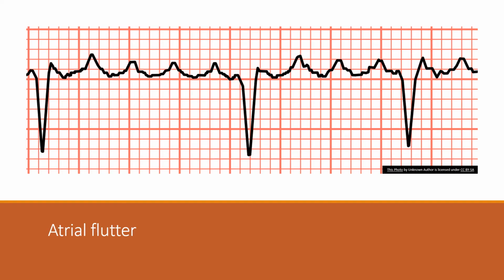This is unique because it's generally a tachycardia. As you can see, I'm depolarizing at a rate greater than 300 beats per minute if you use our one-box method for my P waves. So sometimes you'll see atrial flutter occur, and because the atria are synchronously depolarizing so quickly, the ventricles cannot accept the depolarization because the AV node is refractory.